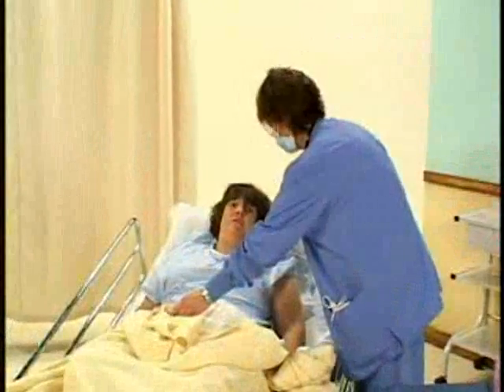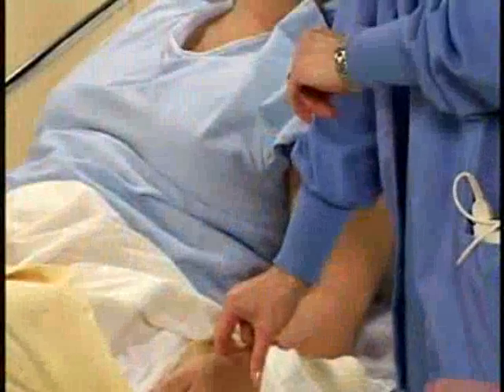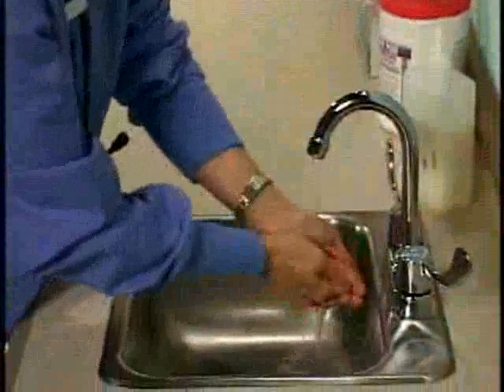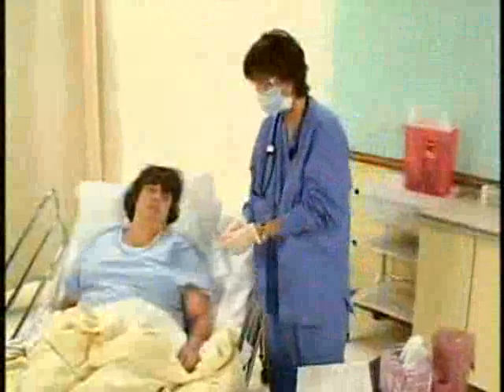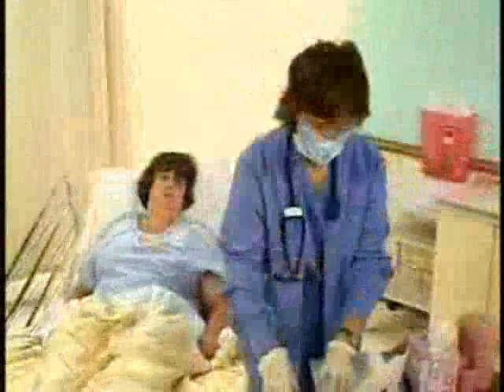Position the client in an upright position for better expansion of the lungs. Assess the client as appropriate. Wash your hands before setting up the nebulizer. Verify the medication the 3rd time and then prepare it for administration.